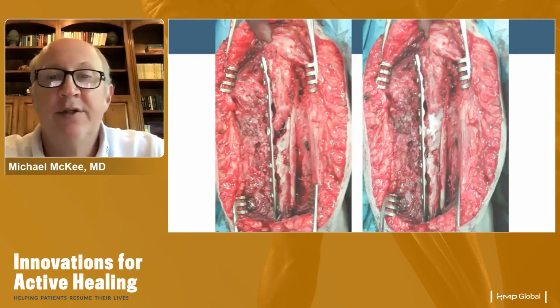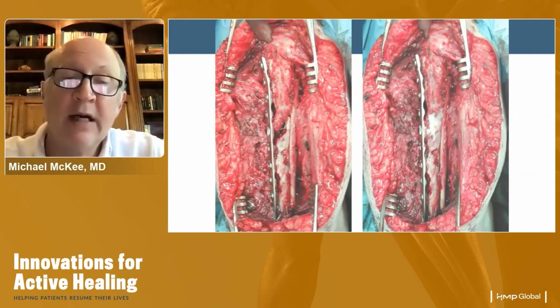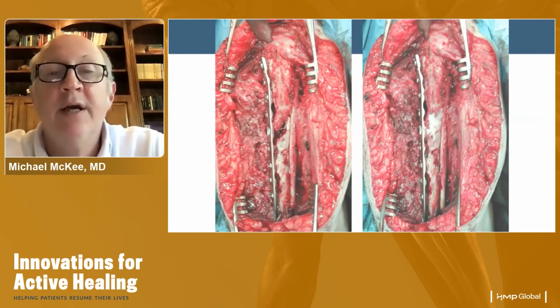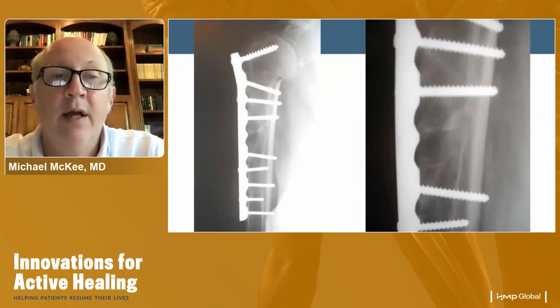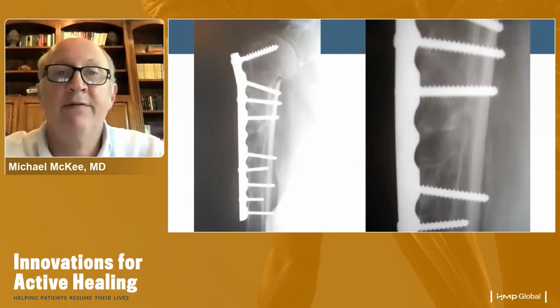In this patient, in addition to preoperatively having her see a nutritionist and changing things a bit, and there's actually a surprising number of things a nutritionist can do, we refixed this non-union. We added a cortical strut immediately to help augment our mechanical fixation from the plate. And then we added a BMP compound directly at the non-union site. And this produced a fairly gratifying union.